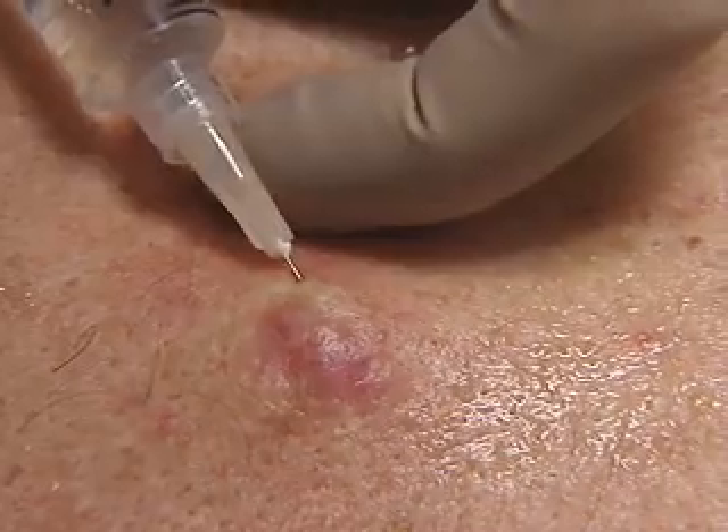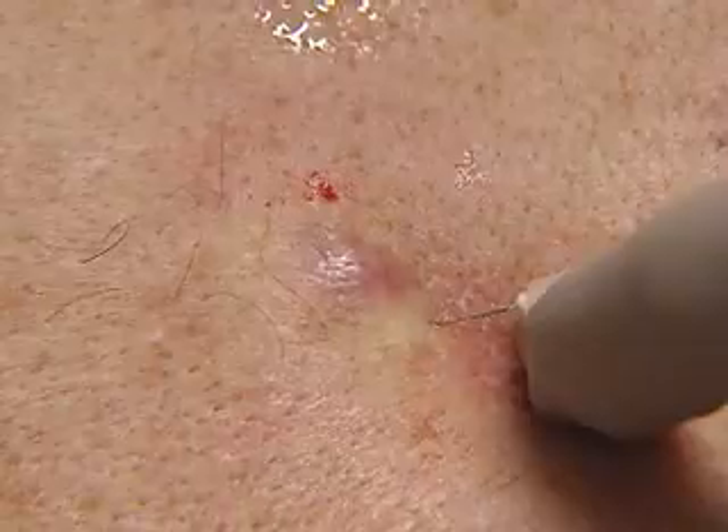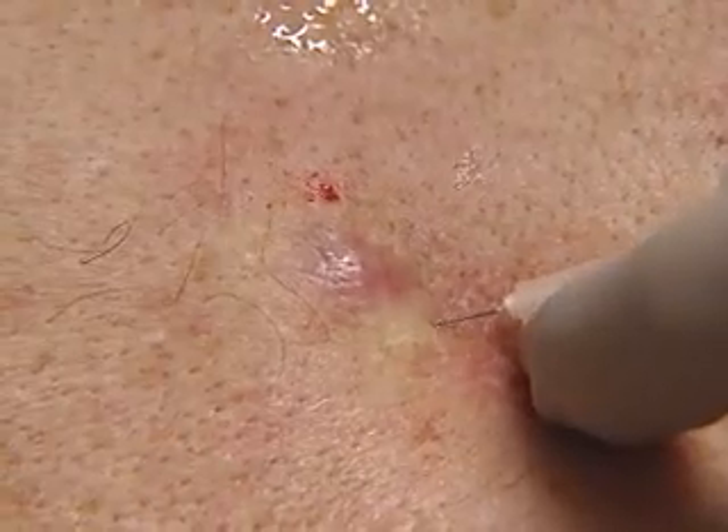And just to be safe, in this case we'll do a third injection to make sure the incision site is well covered, though usually two would suffice.